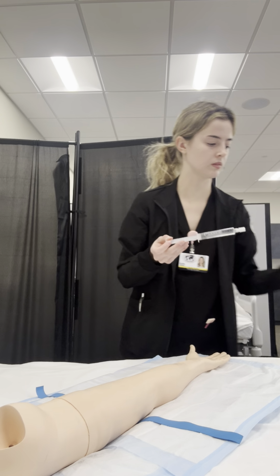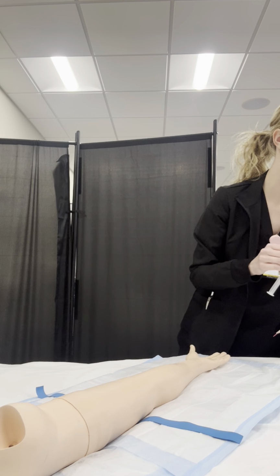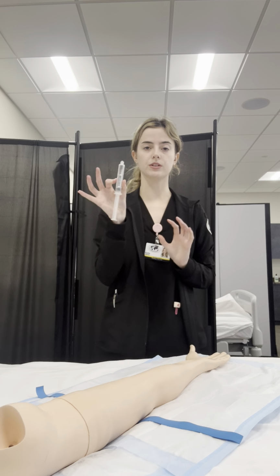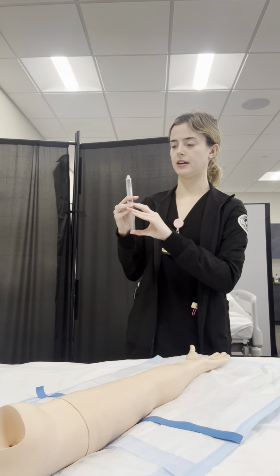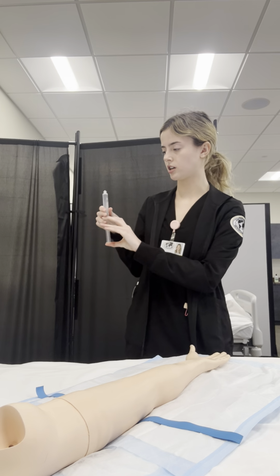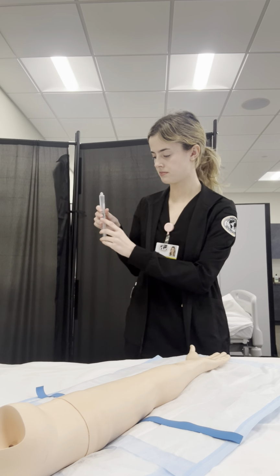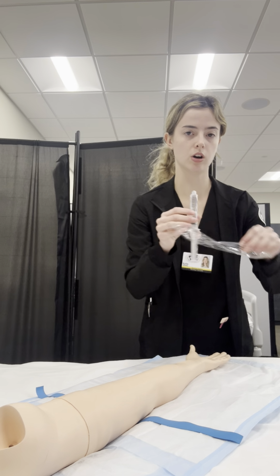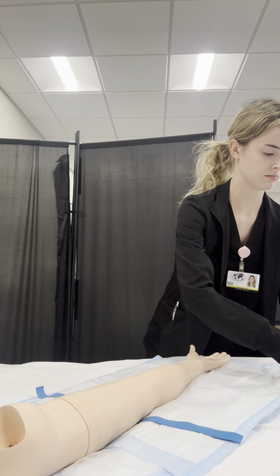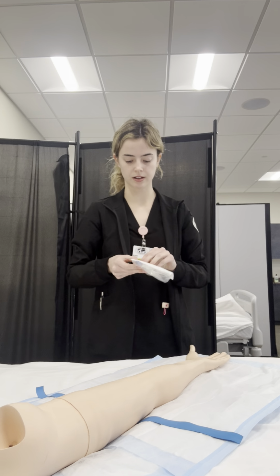Take the cap off. Then I want to get rid of any air bubbles in the syringe as well. And ideally, I would do this over a trash can. Okay. I'm going to set this back down on the packaging. And then I'm going to open my extension set.